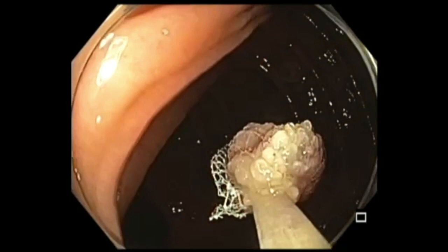I hope this is useful. We have learned about different techniques of polyp retrieval. Those that are small, after doing a cold snare polypectomy, you can suction and retrieve them in the polyp trap that is attached to the suction outlet of the endoscope. Those polyps that are big and cannot come out through the suction channel can be retrieved using a retrieval net.